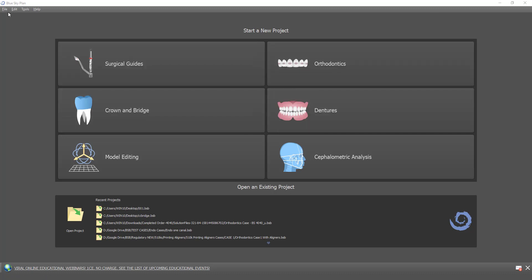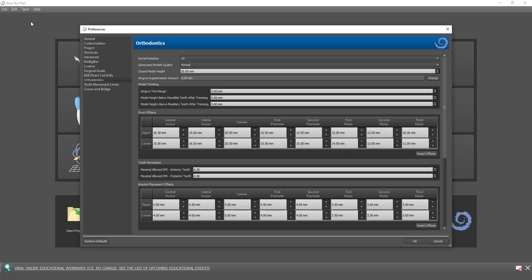Before we get started I want to pull up the preferences. There are a couple of important preferences to note when creating the aligner trim curve for automatic trimming. When we go to orthodontics we can see our preferences panel. The first setting under model trimming is gingiva trim margin — this is the distance under the gingiva margin that the software will automatically create a trim curve to clean up the model, prior to the step of generating the automatic trim curve.